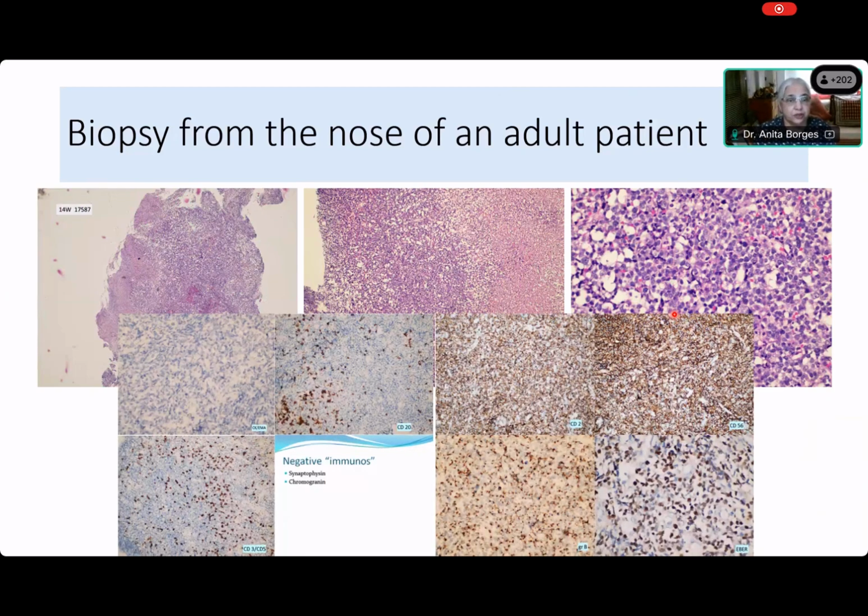Now come on, say, you're third year. And you can see all these things. You see all the immunohistochemistry. Neuroendocrine tumor. It's a neuroendocrine tumor. Please look at what we have done. CK, EMA, is it positive? Negative. Oh, very good. Negative. Then how can you call it a neuroendocrine tumor?